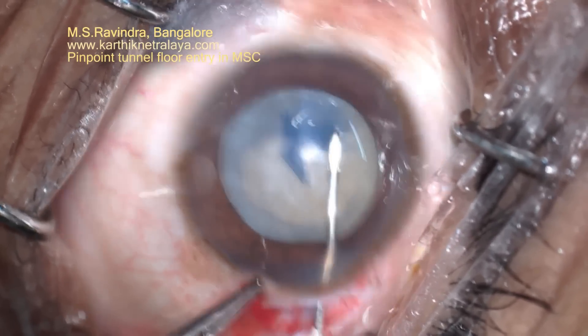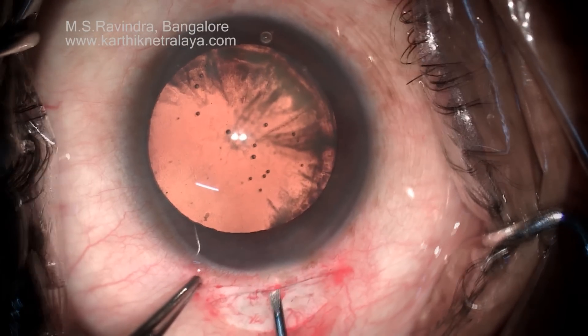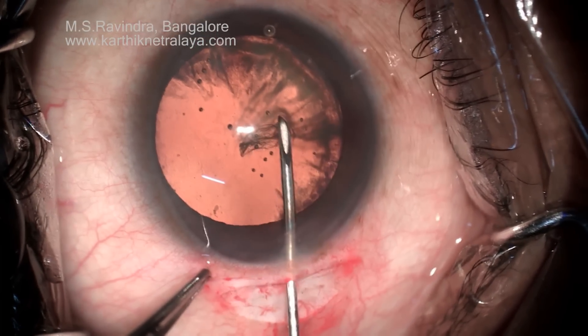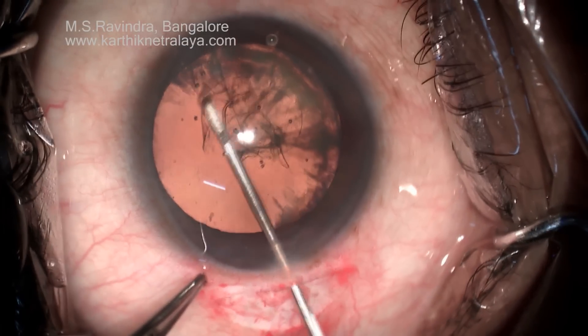You can start using the sclerocorneal tunnel with entry at the limbus, and this can be adopted in any technique of cataract surgery. Thank you.